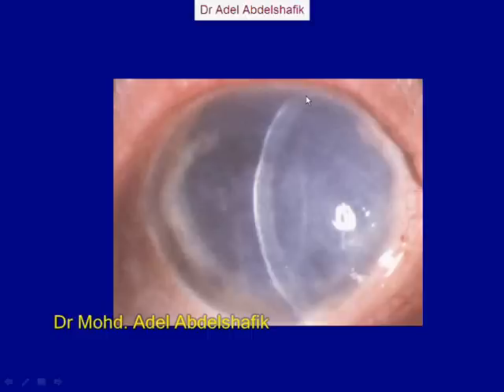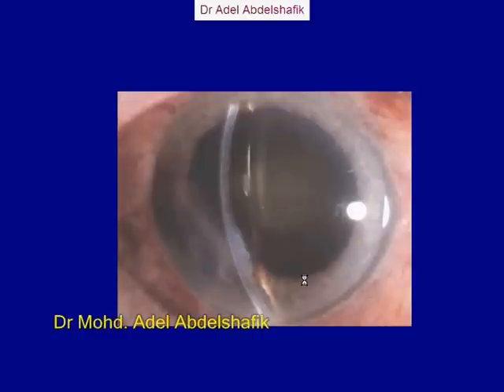If you get this point at the limbus and the other point at the limbus fixed, and you get a certain length of tissue, if you push the tissue inside, then this surface should be folded. Imagine you get a thread attached to this point and to the other point here, and it is stretched. If you push this thread inward, it must have some folds to cover this shorter area. That's why you get folds of the Descemet's membrane. When the edema subsides, the surface goes forward to its normal position and the Descemet's folds will disappear. This is the explanation why we have these folds in the Descemet's membrane.